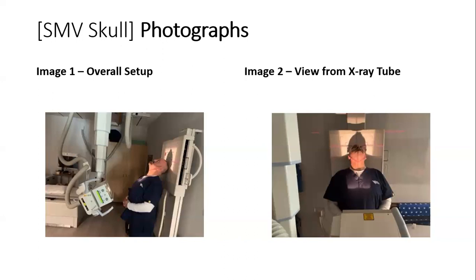The pathology for this examination is any external or internal fractures of the skull. The end.